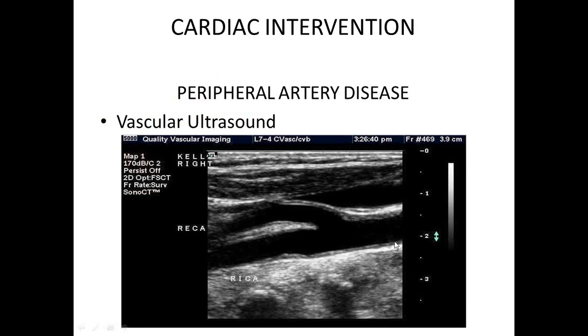If you look, you can see what we call the intimal thickening. And that's very important for us to measure, because intimal thickening will give us an idea of atherosclerosis and atherosclerotic burden. So we usually measure the intimal thickening. That is this little thickness right here. So it's easy to image the carotid, okay?